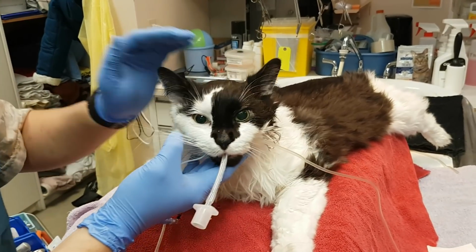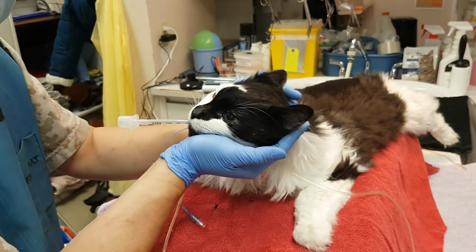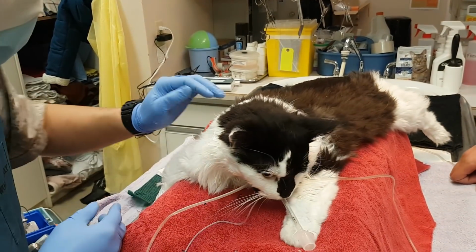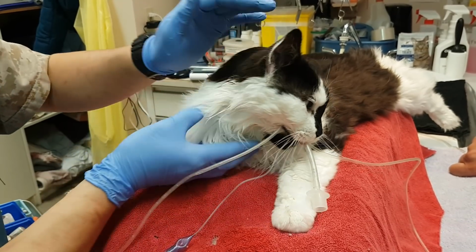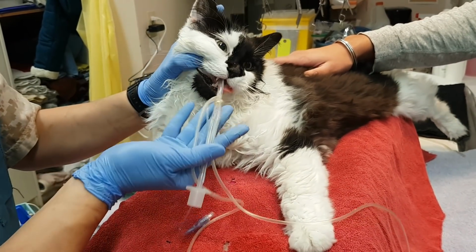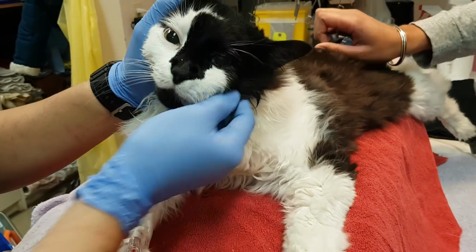Oh, there's a little swallow, and he's up. We trimmed just a bit, but this really took about 3 or 4 minutes. He's picking his head up, but he's still quite dopey. Does he have a swallow reflex? Does he? Oh, I think we saw him lick a little bit there. And come on, Lancelot. I just gave the instruction, and Mr. NJ is pulling the tube, and our patient's fully recovered from anesthesia. Well, maybe not fully recovered.